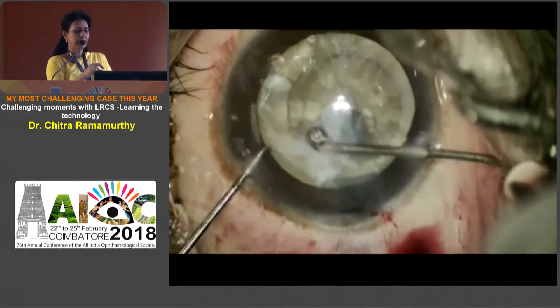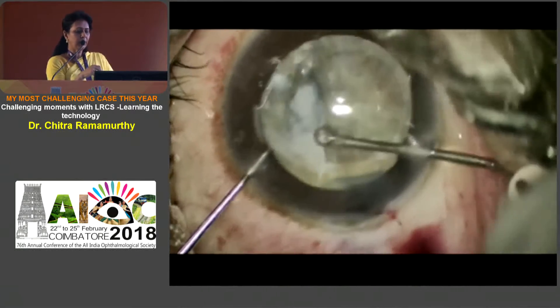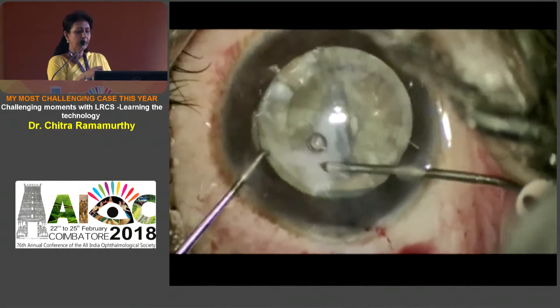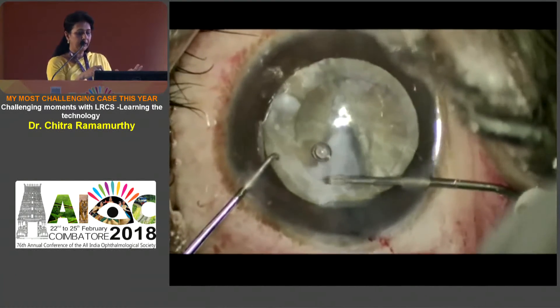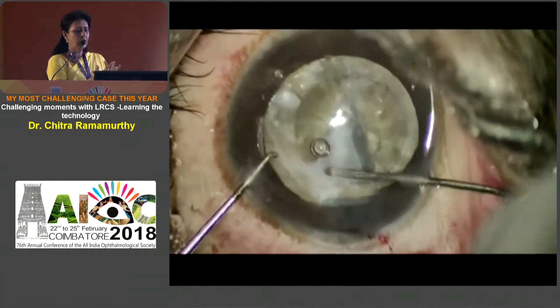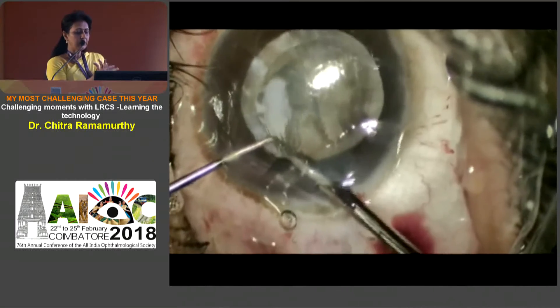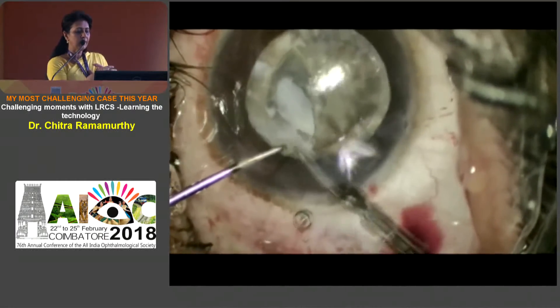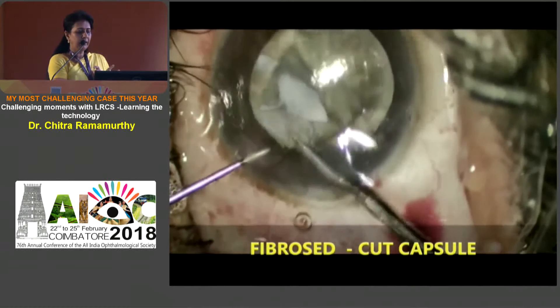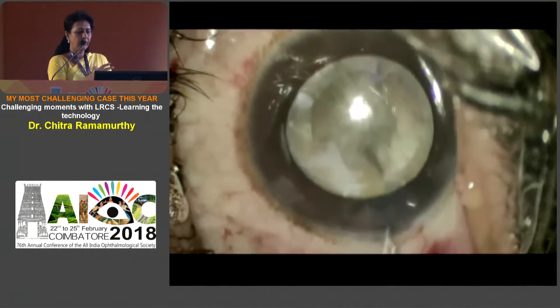In this dense area where the fibrosis is very intense, I tried whether I could manually exert some force, but I realized that I could end up creating a dialysis. However, the best of technology may be seated on, but you may have to be realistic. At this point of time I go in with the scissors, and circumferentially, in that particular area, I make a nick to ensure that I have cut the capsule margin.